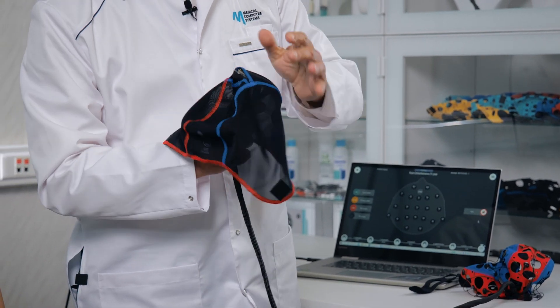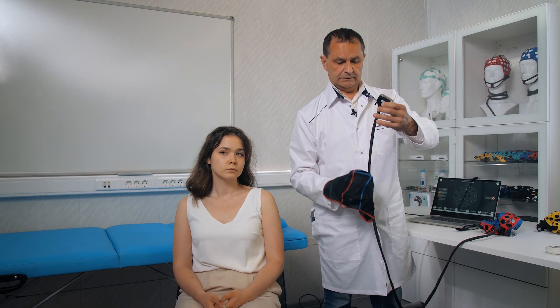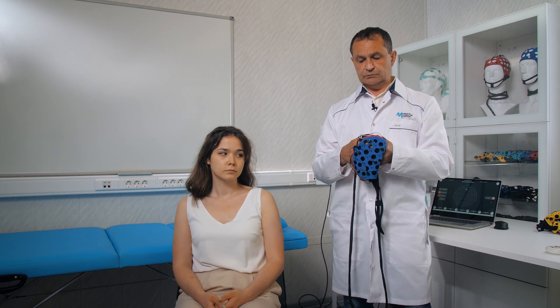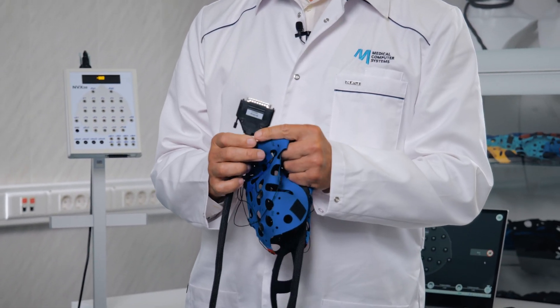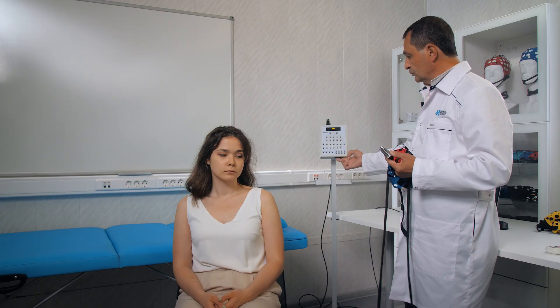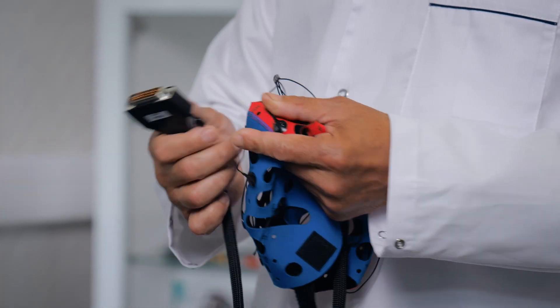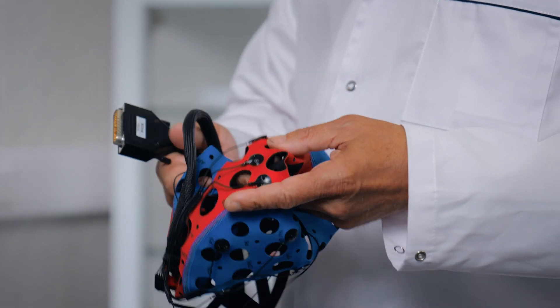Now we will place it on him. There is a designated slot where we thread the main cable through, specifically designed for this purpose, allowing us to securely pass the main cable and ensure proper connectivity. The cable, similar to the helmet used in the clinic, comes to an end with a connector designed to fit into the input connector of the electroencephalograph machine. Various manufacturers have different connectors, so the corresponding part is installed based on compatibility with a specific manufacturer.